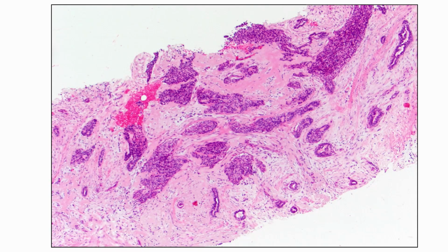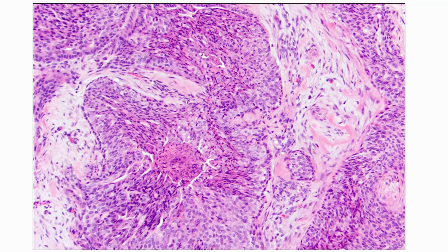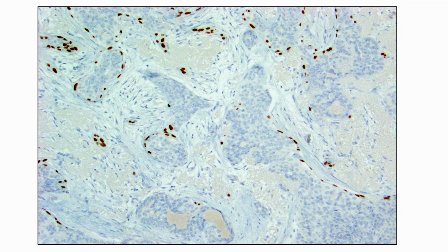This is another case where I think one could be mistaken and fall into a trap of invasive carcinoma. We've got this fibrotic stroma, distorted and irregular nests of epithelial cells, and even some necrosis here. But if you look carefully at the epithelial proliferation, it looks very heterogeneous. We've got slit-like spaces, variable nuclei, and even probably a myoepithelial cell layer here. So even if you have necrosis, you still need to think about usual ductal hyperplasia.